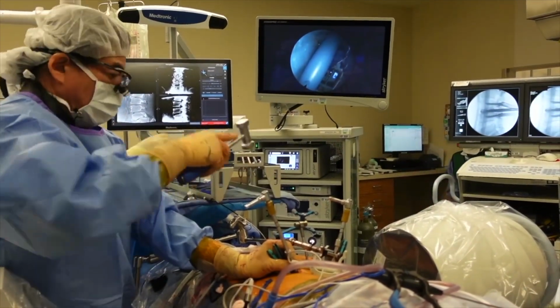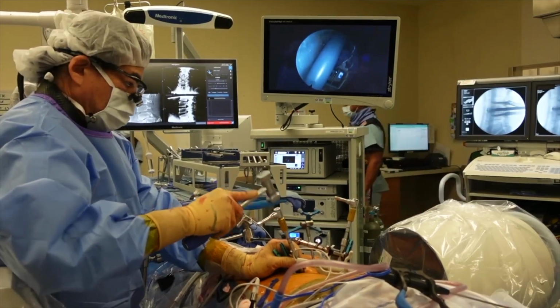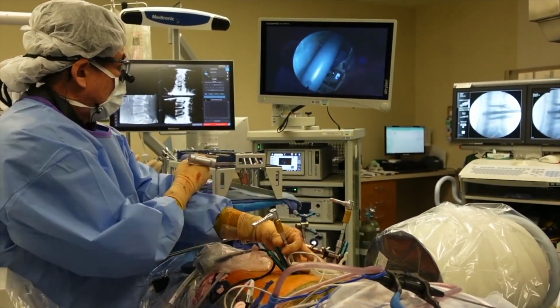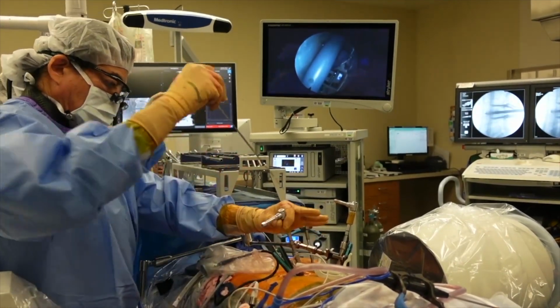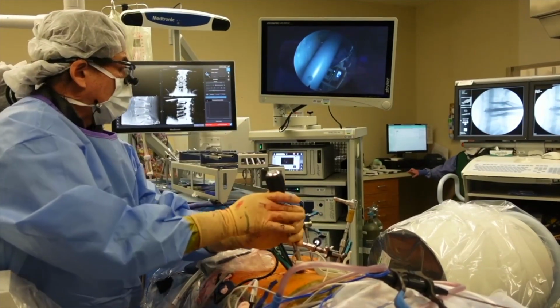Now, X-ray. X-ray. I see it. Expanding device. This is going to look stellar. I can already feel it.